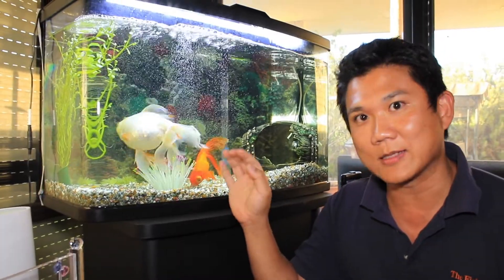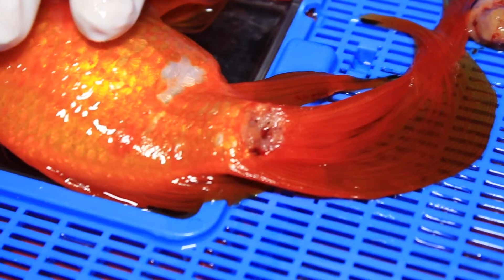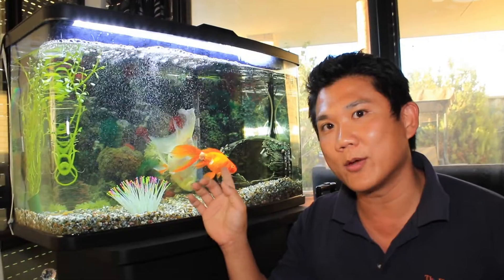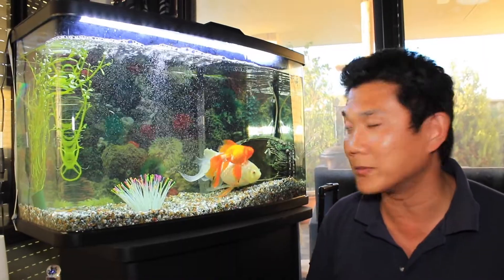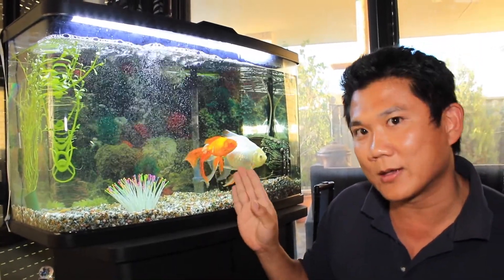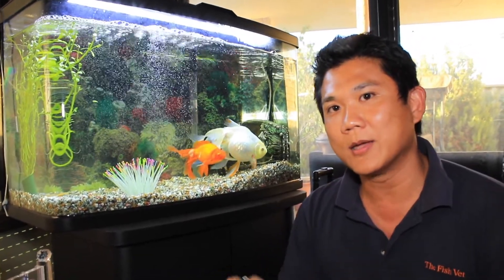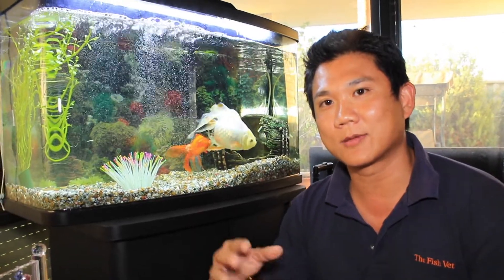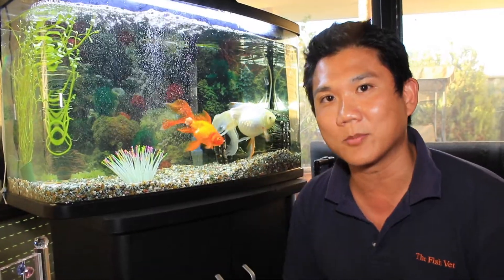On the same side of Golly — her right-hand side — there's a patch on her abdomen with depigmentation where it's white. That's the site where we originally removed a different lump, but now she's grown another one. When we remove a lump and the area heals, you may get colour differences — not quite the original pigmentation, maybe just a non-pigmented area.